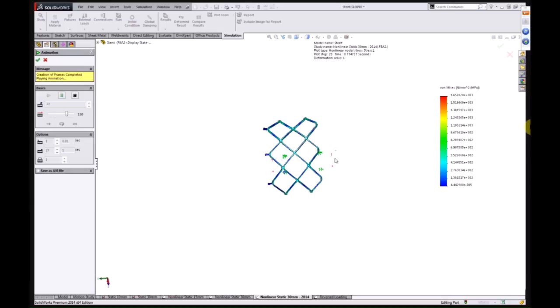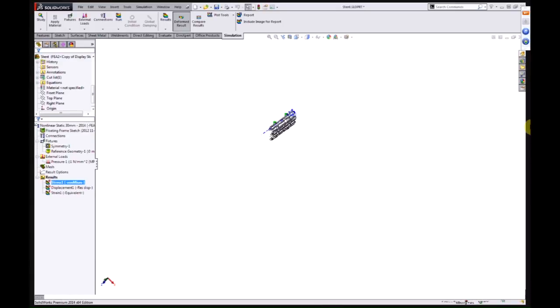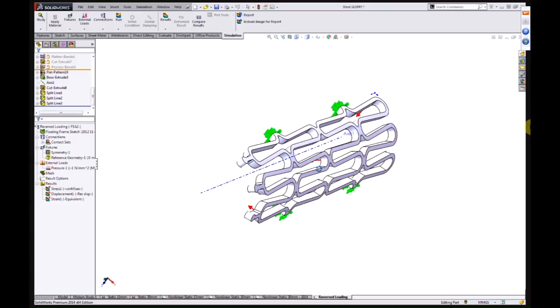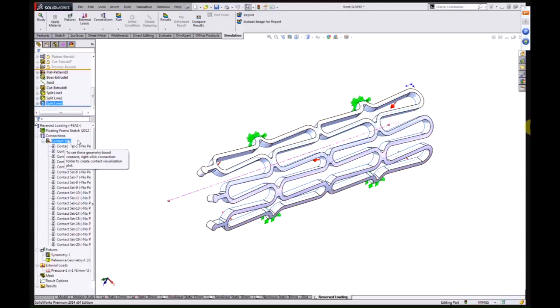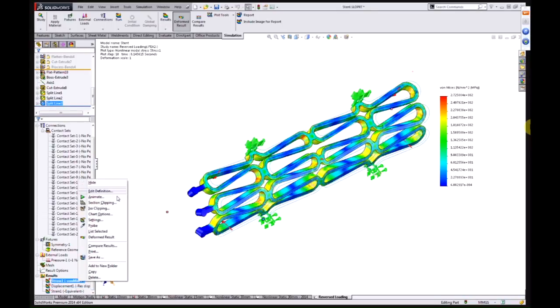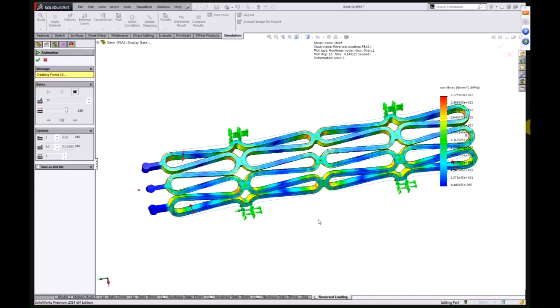Or if we try to compress the shape, pull it inwards, we very quickly get to a point where the arms start to rub together, and we resolve that with contact interactions between all the faces that may meet. Once we start getting into contact modeling, things get a little tougher for us in SOLIDWORKS Simulation Premium. If we were to compress the thing, we get to the point where the parts come together. We can resolve a little bit further, but ultimately the degree of deformation we can see going inwards is a lot smaller. This is in the ballpark of the limit of what we've been able to achieve.